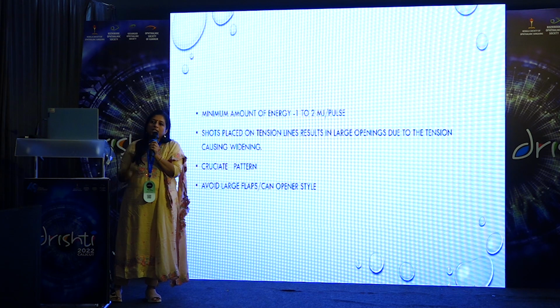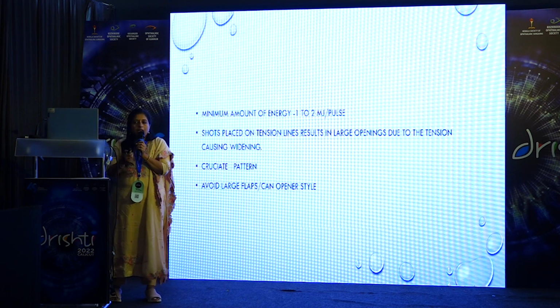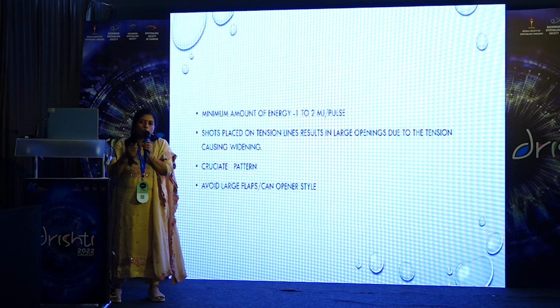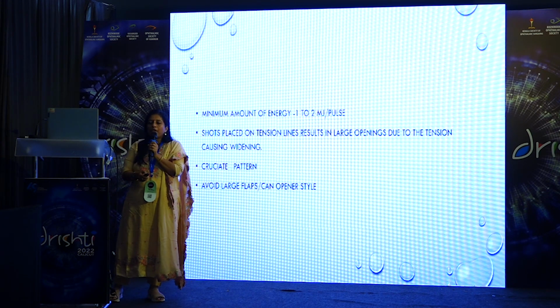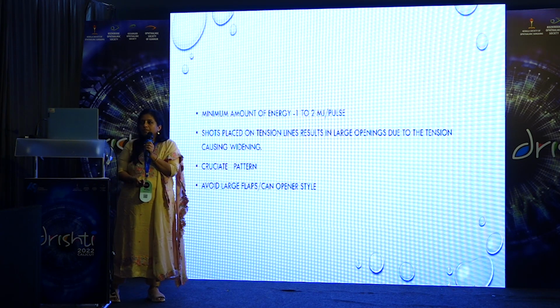The shots are placed on tension lines so that with the small burst itself, the break happens along the tension line, which will slightly enlarge. We should always try to follow the cruciate pattern of doing a capsulotomy and also try to avoid larger flaps and the round can opener style of doing a capsulotomy.